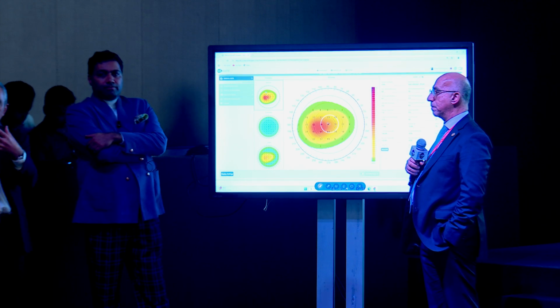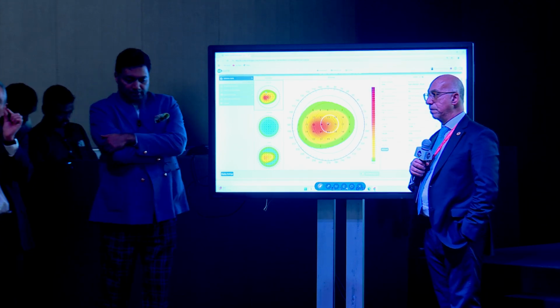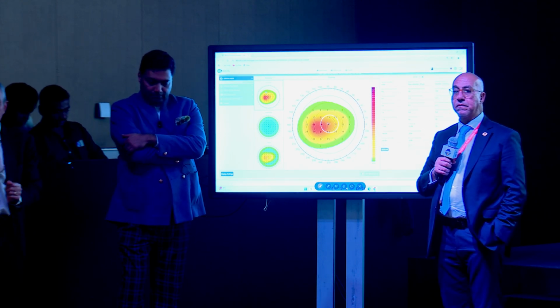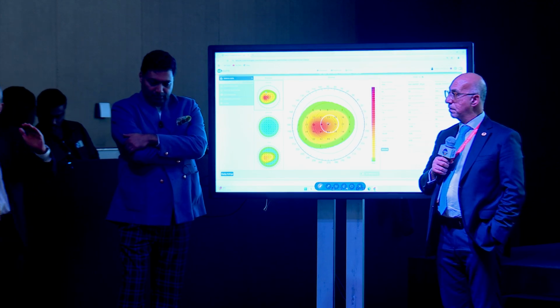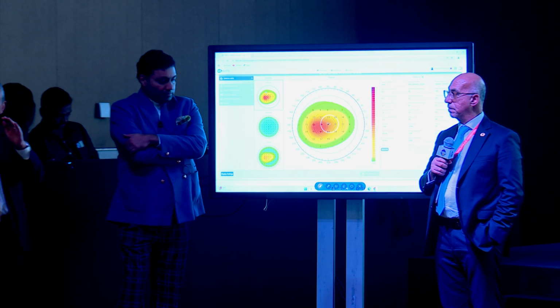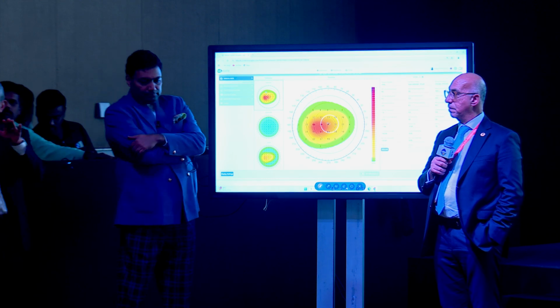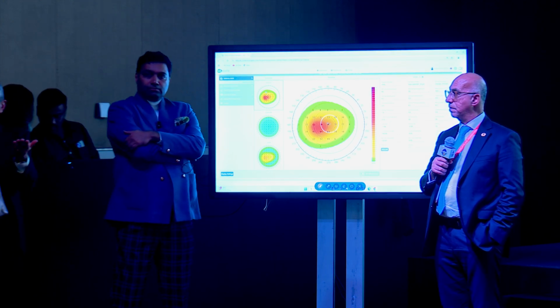So again, the idea is basically to give, within the refractive zone, limited to what the patient really needs, the quality of vision. But, as he said, in order to grant stability, we need not to make a constant width connecting zone; the connecting zone must change its width in order to grant, again, a homogeneous smooth gradient, in order to allow the epithelium to regrow homogeneously.